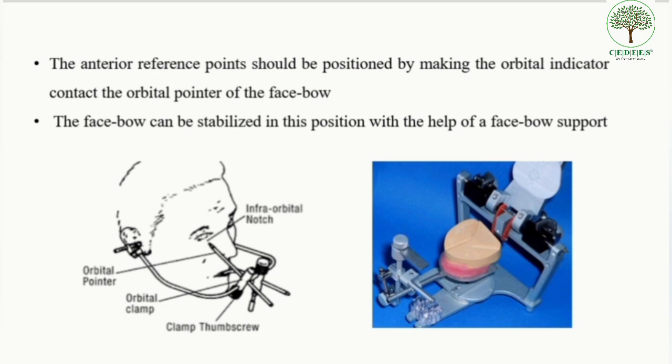The face bow is stabilized in this position with the help of a face bow support. Then the maxillary cast should be placed in slurry water for at least five minutes for better adhesion of the cast to the mounting plaster.